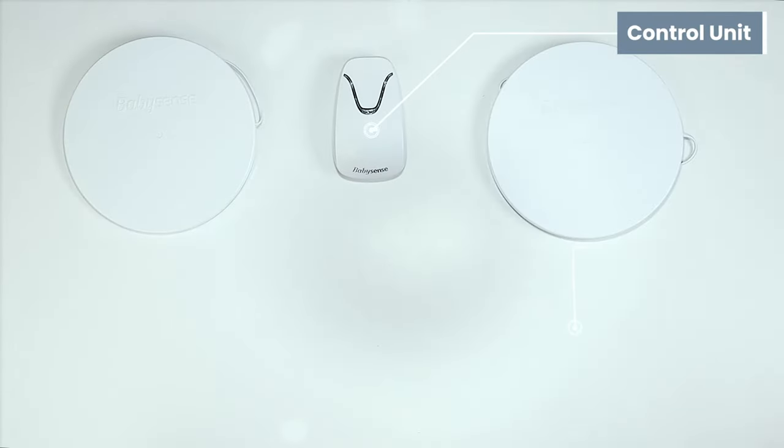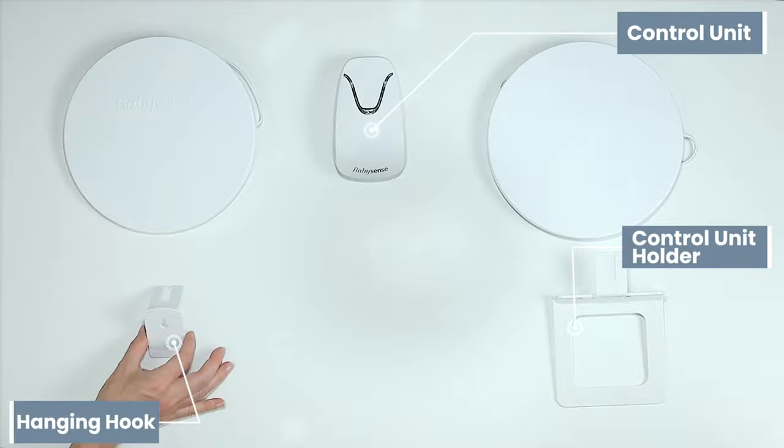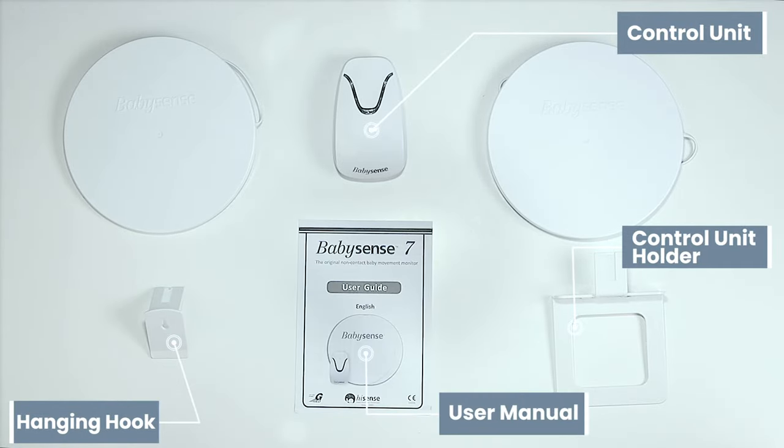Inside the box you will find the control unit, two sensor pads, control unit holder, hanging hook, and of course, the user manual.